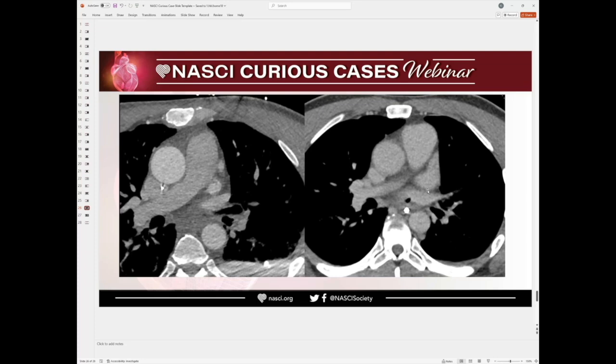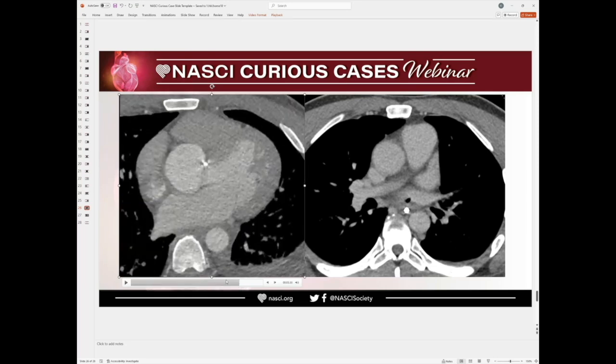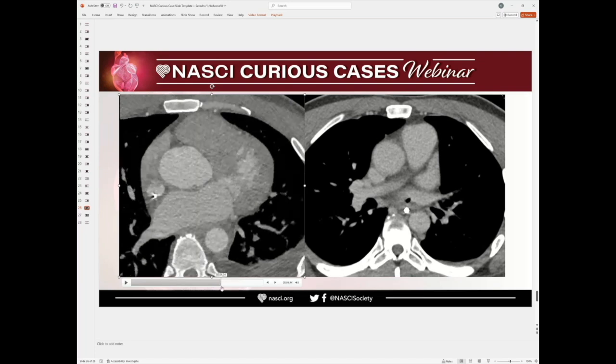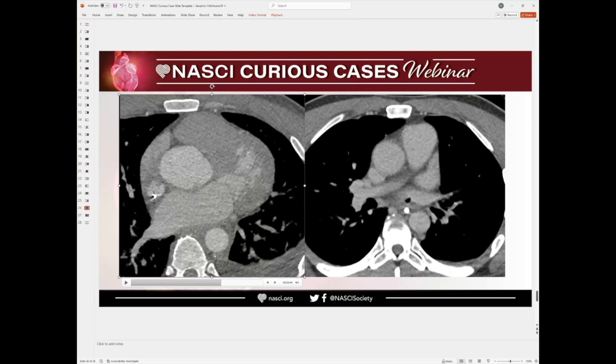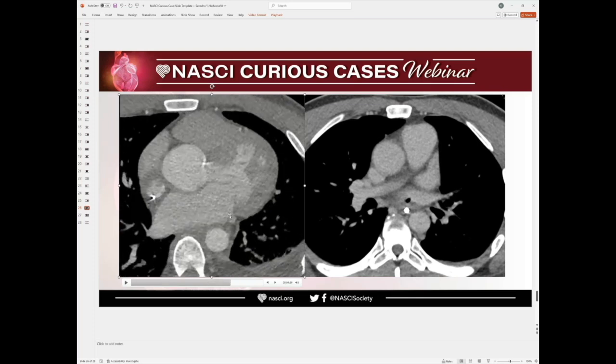Definitely right. There was another case, I couldn't find it. It was a pericarditis case, and it happened after this, and I was trying my best to see if there is any atrial fistulization. It was a non-con scan, unfortunately. And as you just said, we said there's some loss of fat, stranding around it, so we cannot exclude. That case, we got a CT of the heart, and we proved it. Even though I was looking for it, I still couldn't see it, but that was a non-con CT.